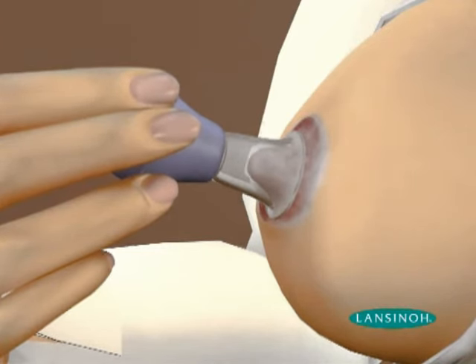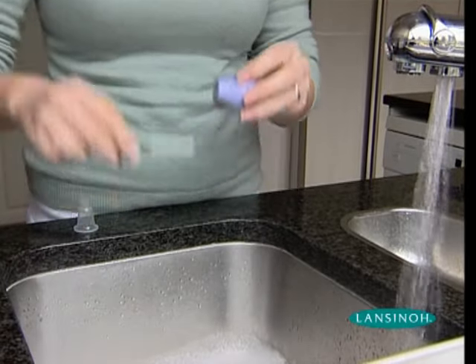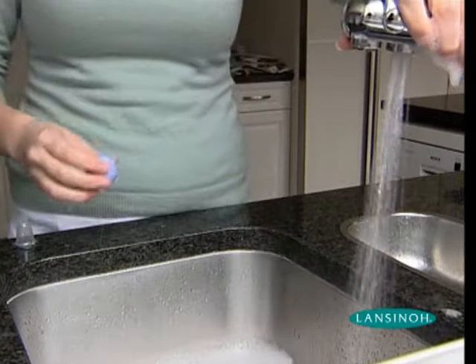Before use, take the Latch Assist apart and wash it thoroughly with hot soapy water. Rinse and air dry.